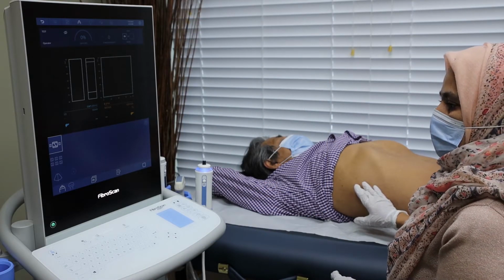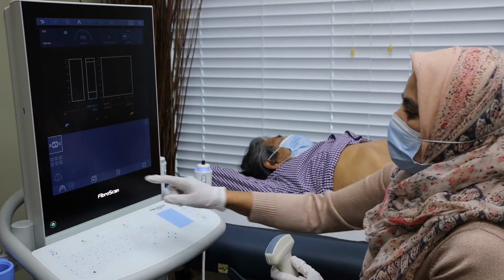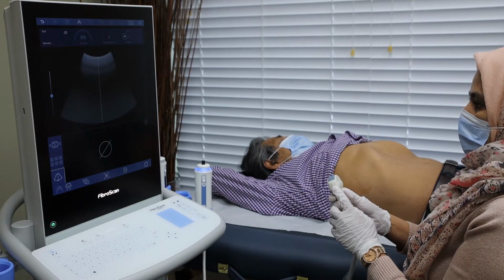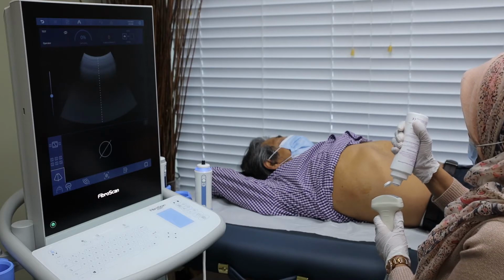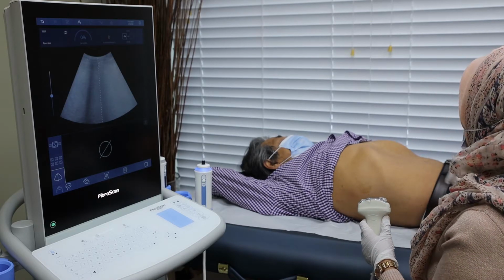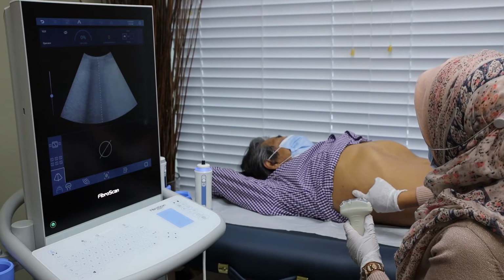By using the ultrasound probe, we can localize the liver as well. The probe becomes active when I select the ultrasound probe on the Fibroscan screen. The vertical line on the side of the ultrasound probe will again be towards the patient's head. With the help of this ultrasound probe, we can now easily localize the liver in obese or post-hepatectomy patients.